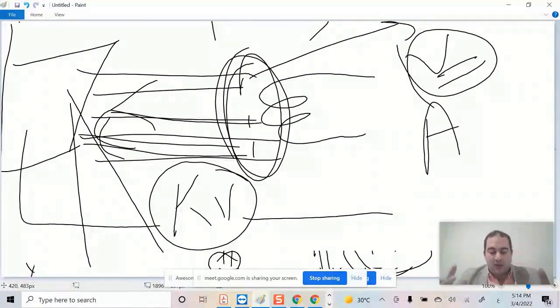Okay, what change occurs in the spectrum? When I talk about milliamps or the tube current or the filament current, any increase in tube current or filament current will lead to an increase in your quantity of X-rays.